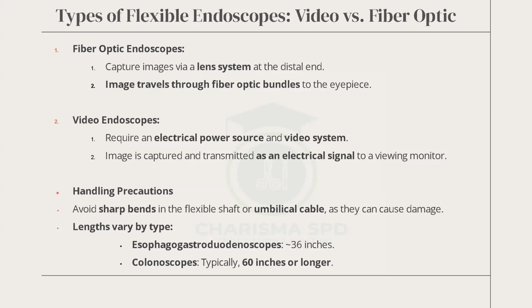I still have them, and you can see the surgeon was right, because what the technician did is questionable. It does not show professionalism, and it is about to break and cost the hospital. So avoid sharp bends in the flexible shaft or umbilical cable, as they can cause damage. We have seen that several times.